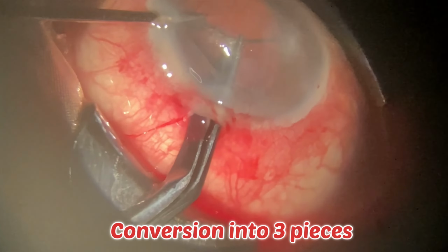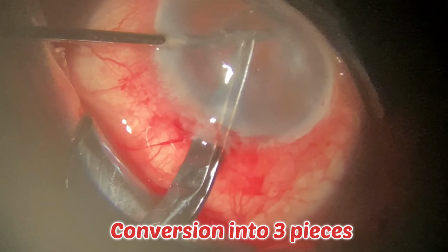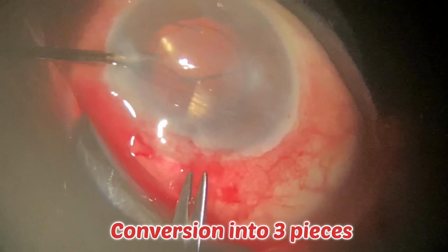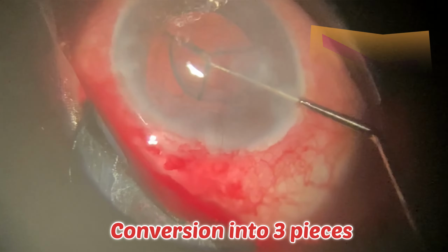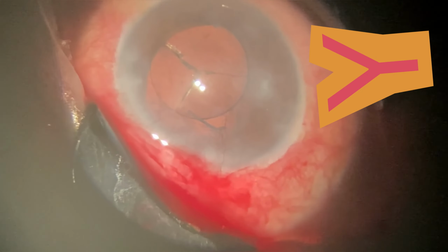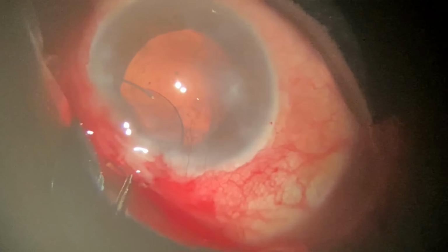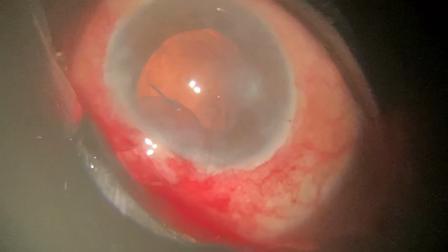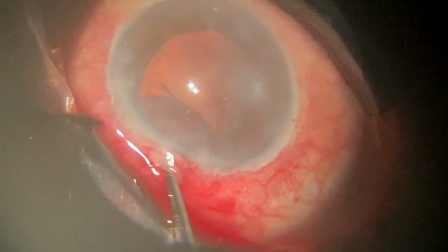Holding it with the micro forceps and giving the cut through the main entry using a curved scissor. So this was the final cut. Removing the IOL by holding it with the McPherson forceps.